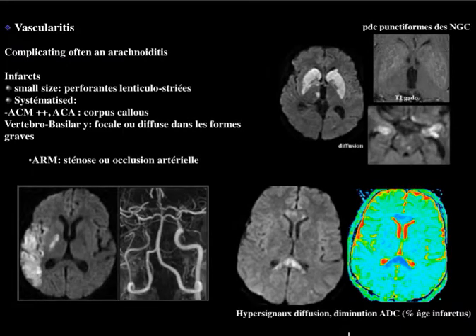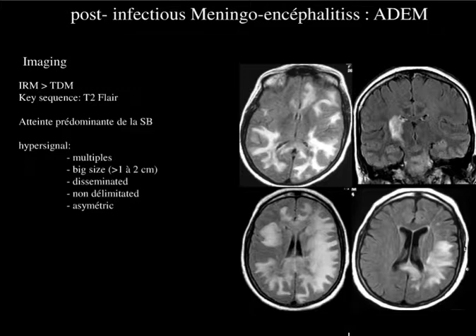And it is very important, if you suspect the diagnosis of vasculitis or cerebral meningitis, to do an MRI, and you will see sometimes small cerebral infarcts or sometimes a very severe and large stroke. And sometimes these particular abnormalities of the cerebral artery, which are very typical. This is a very important diagnosis.